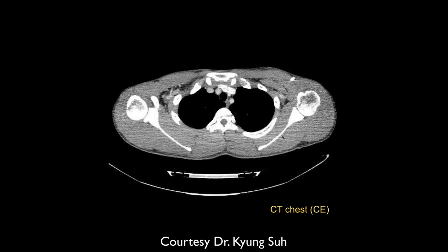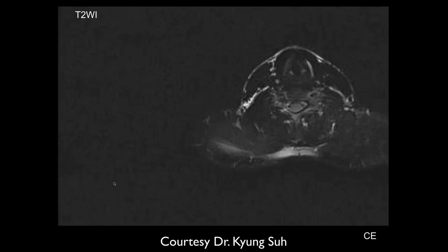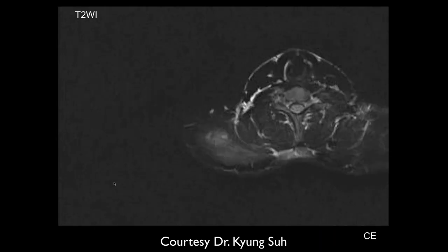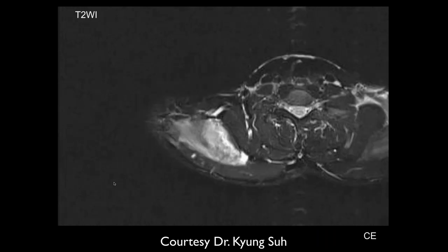I think it's muscle edema. I don't know how much of this is artifact, but it looks like there's asymmetric density in the musculature. Maybe. Oh, that. Okay. Yes. So it looks like probably edema on the left then. No, I'm sorry, the density is less than the left. Pretty subtle. Yeah. Here's the MR. Yes, the edema, and so it's the supraspinatus.